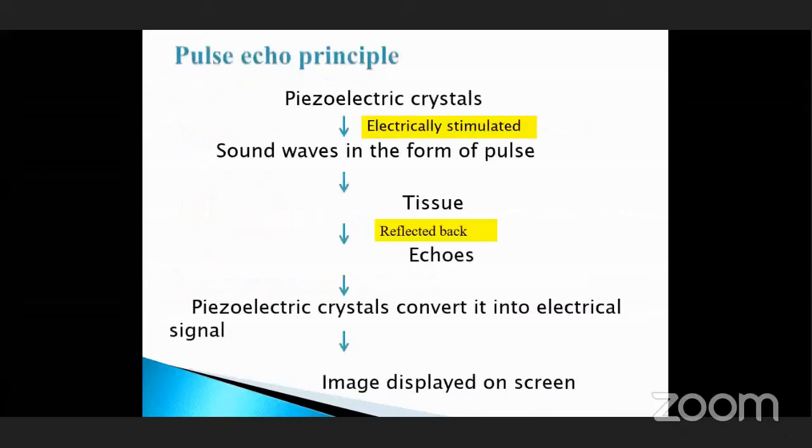Now, ultrasound is basically based on the pulse echo principle. There are certain materials, also known as piezoelectric crystals, which have the inherent tendency to change their shape and produce sound waves whenever they are stimulated. So they have the inherent capacity, and these are known as piezoelectric crystals.